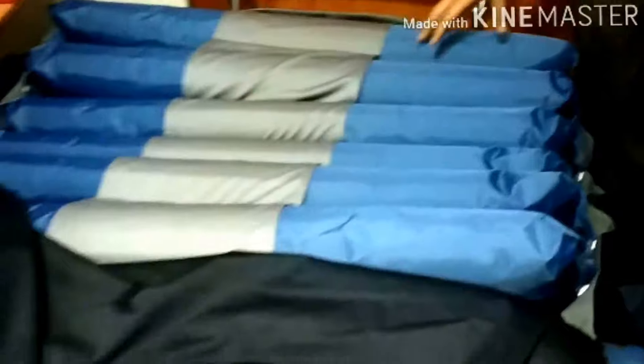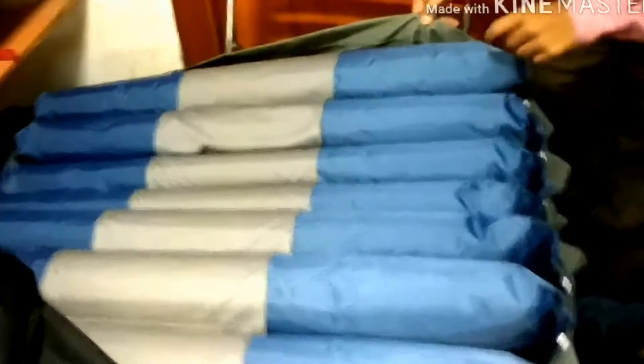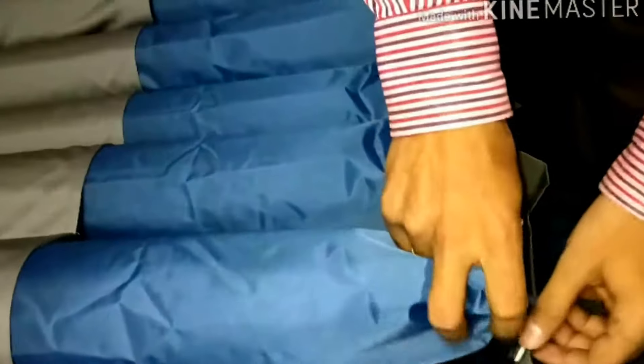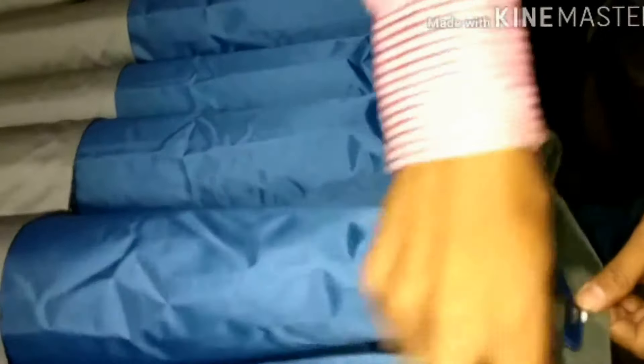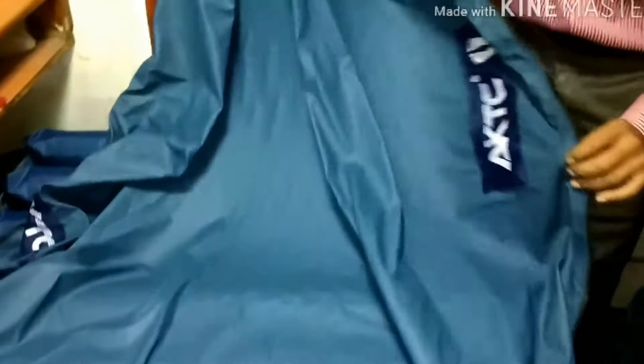This air mattress is not like a usual air mattress because it contains 21 different small cells, which are attached to an air pipe inside the mattress. These 21 cells are covered with a covering which you can zip over it, and it is washable.